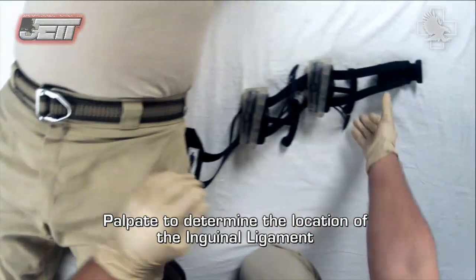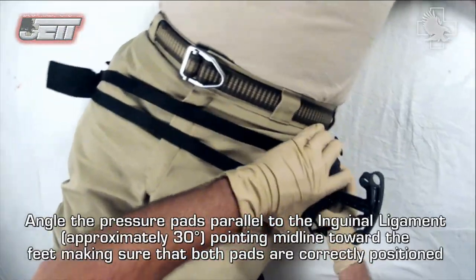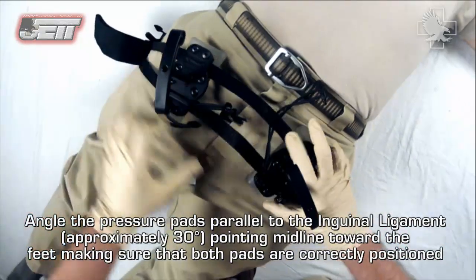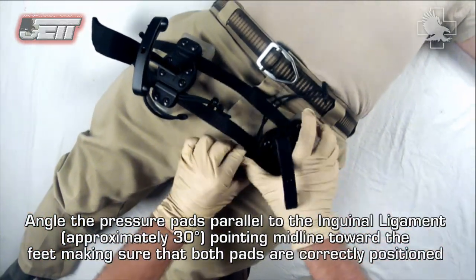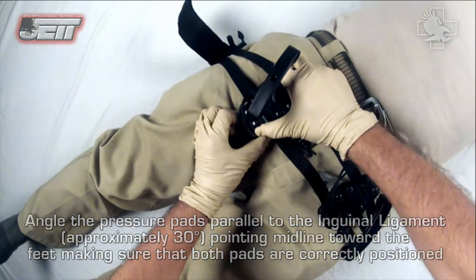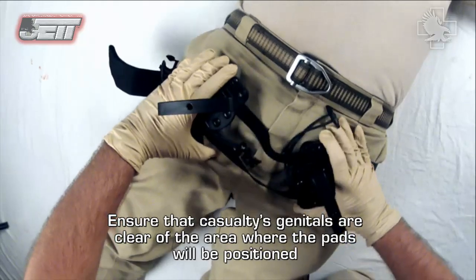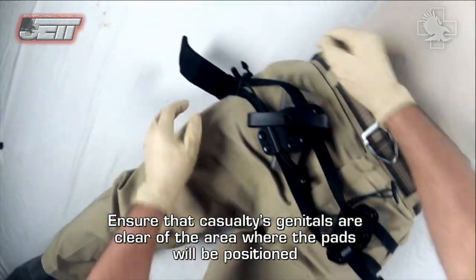Palpate to determine the location of the inguinal ligament. Angle the pressure pads parallel to the inguinal ligament, approximately 30 degrees, pointing midline toward the feet, making sure that both pads are correctly positioned. Ensure that the casualty's genitals are clear of the area where the pads will be positioned.